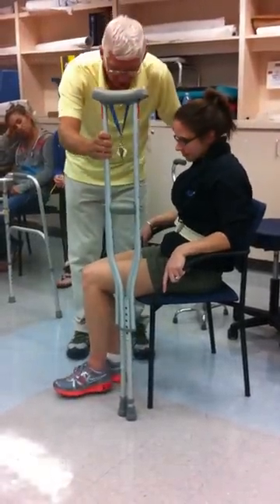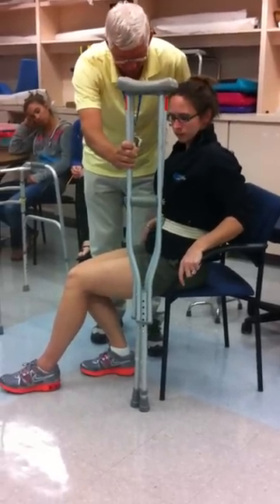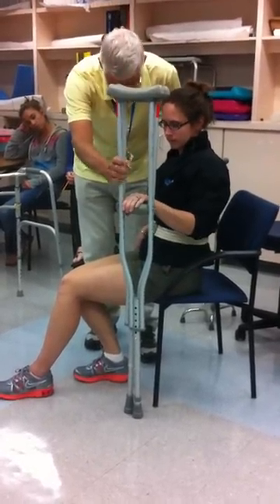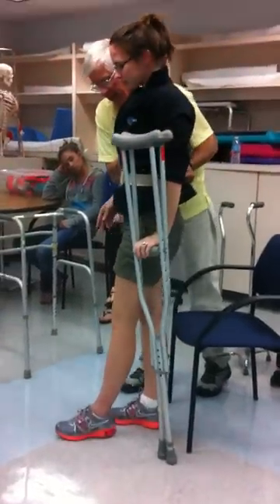Here's the deal. Scooch your bottom forward. You're still non-weight bearing on the left. Go forward. And take that left hand and put it in the crutches. Okay, you're going to stand up here. Push off. And I'm going to go with you. Get your balance.